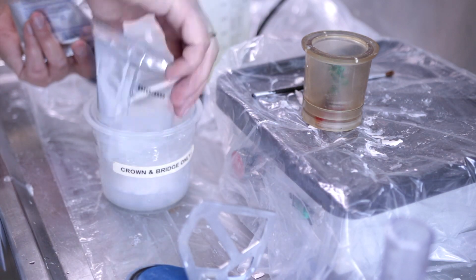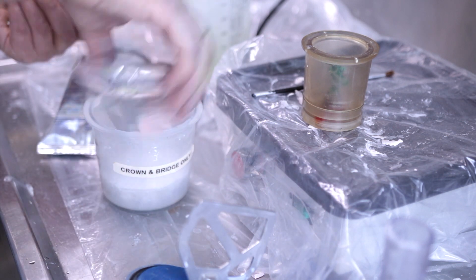Mix the ideal powder and liquid ratio by hand, and then mix under vacuum.